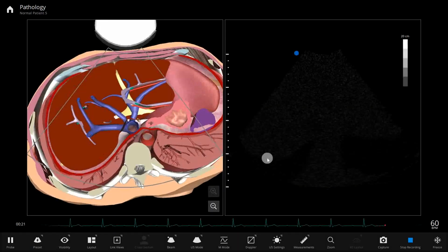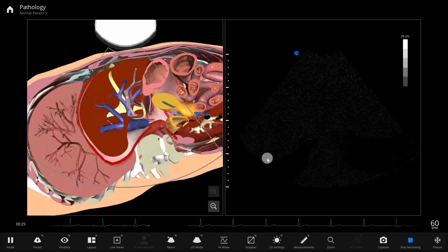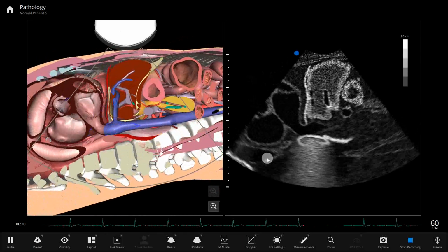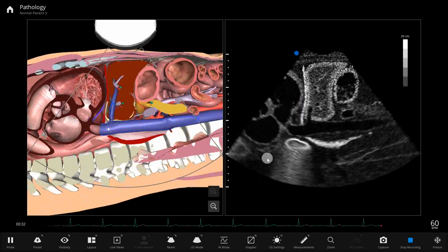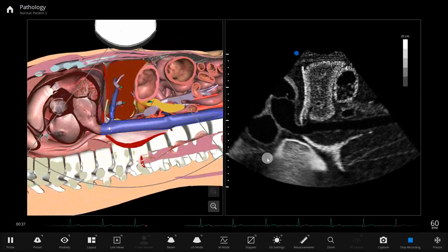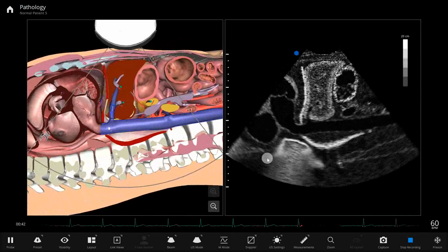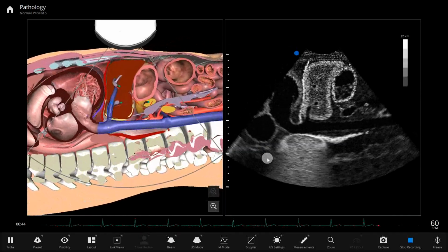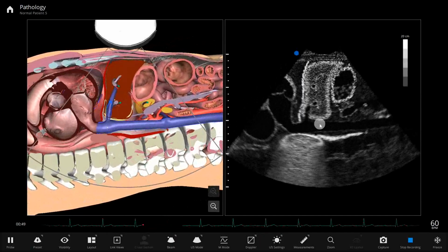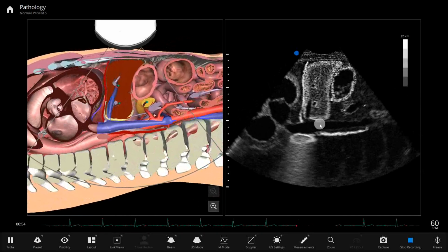We're going to start by turning sagittal and looking at the length of that IVC. So here we go. We're going to fan to center. There we go. And we're going to see that IVC entering the right atrium of the heart. You can see it on both the sagittal image on the anatomy and again on the ultrasound image over here. I have removed all of the shadowing from bone and all of the shadowing from bowel just to give you a better look at things, okay?